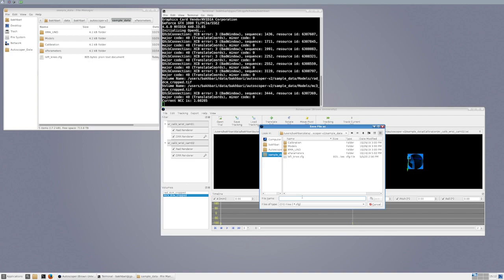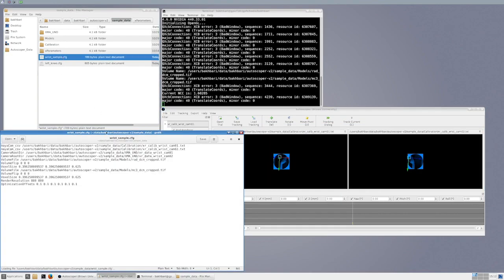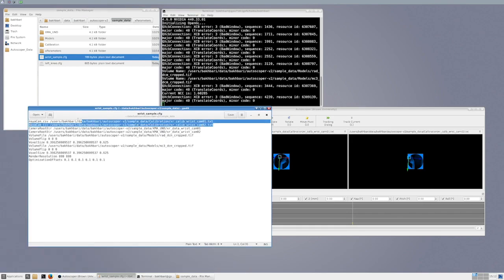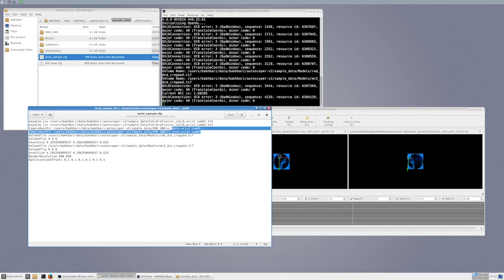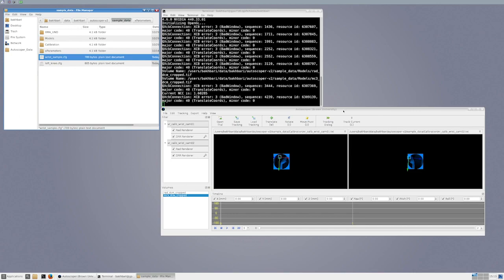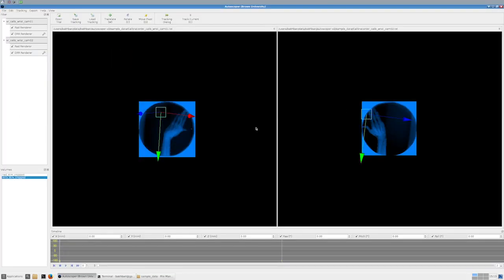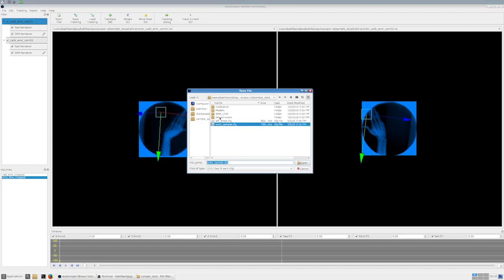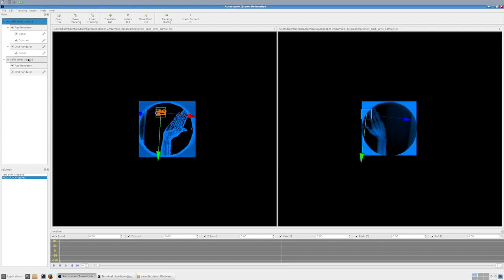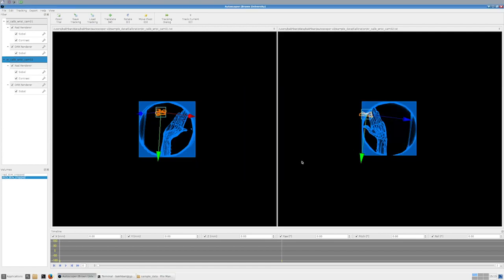After pressing OK, the wrist data is loaded. Before doing anything else, let's save the config file — I usually name it based on the bone of interest or subject. Opening this config file shows the calibration path, radiograph paths, and three lines for every bone model including the render resolution and optimization offset, which we'll discuss in later videos.